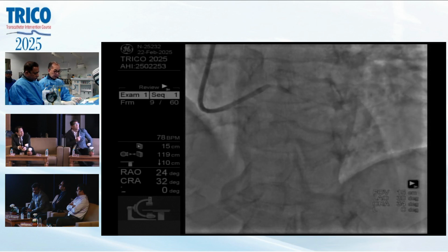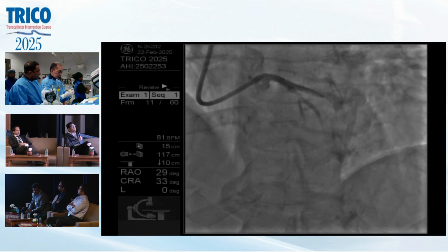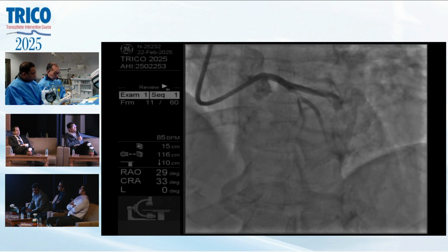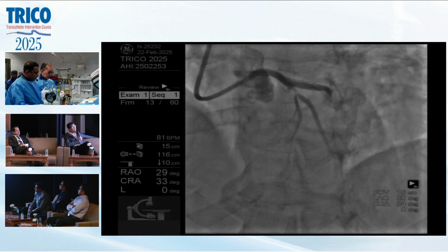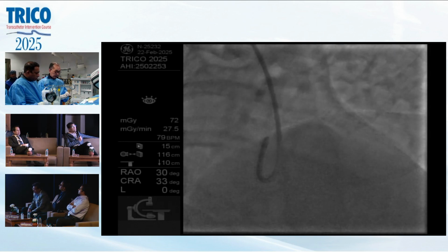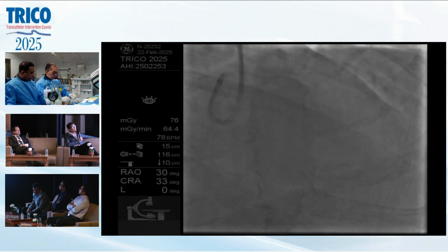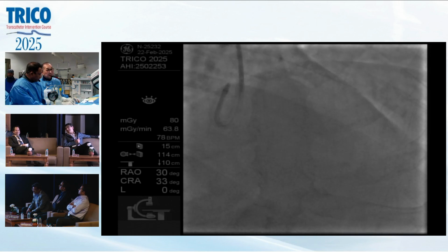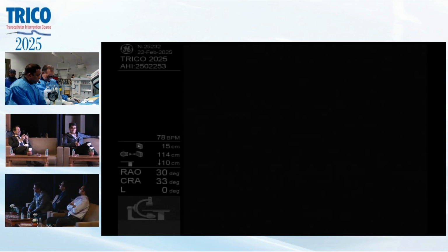Okay, now we will give some history. Give me one second. What history was already given? We already heard the case history. Oh, you did? And in fact, the lesion looks a little bit less angry compared to the diagnostic angiogram. You heard the history, but I did not. Okay, take a test. It's good. Okay, good. Ready? Yeah, ready.